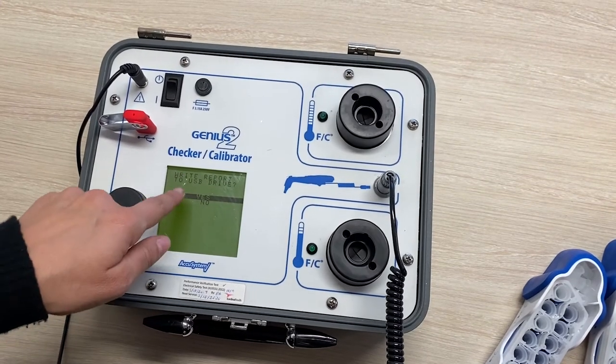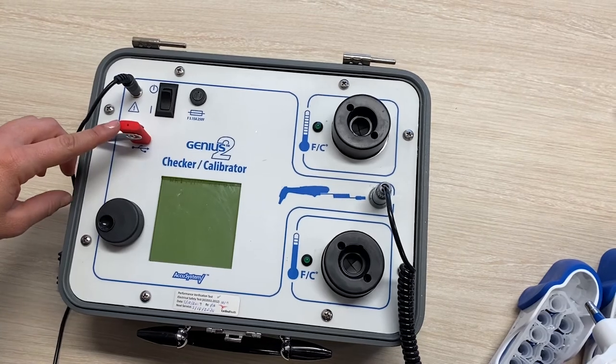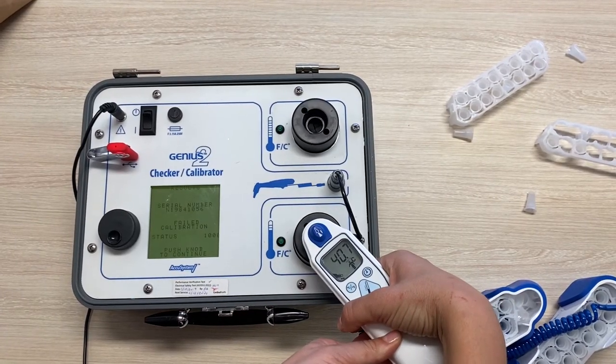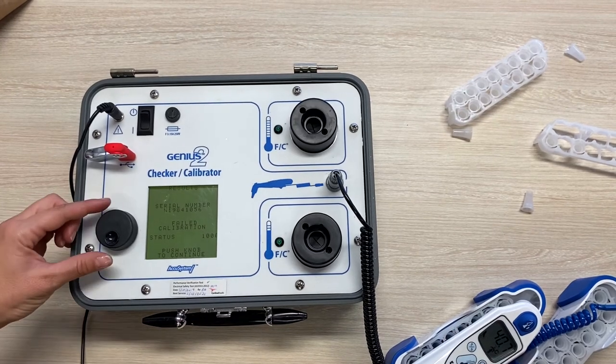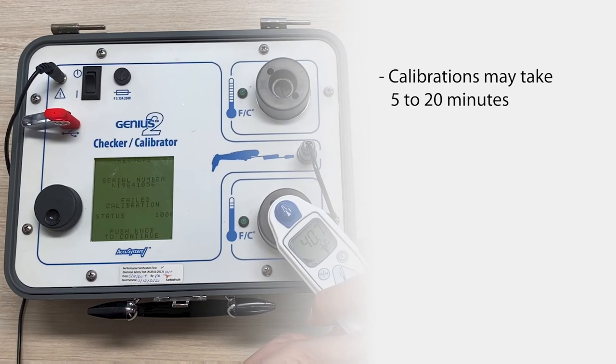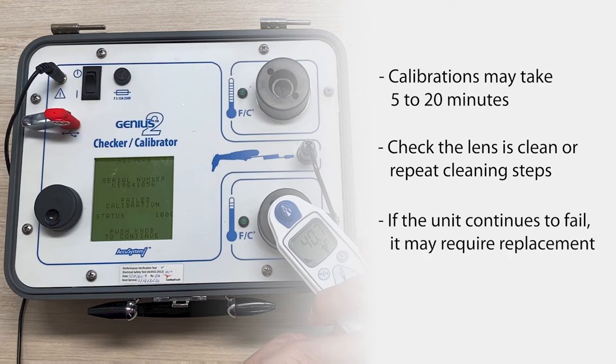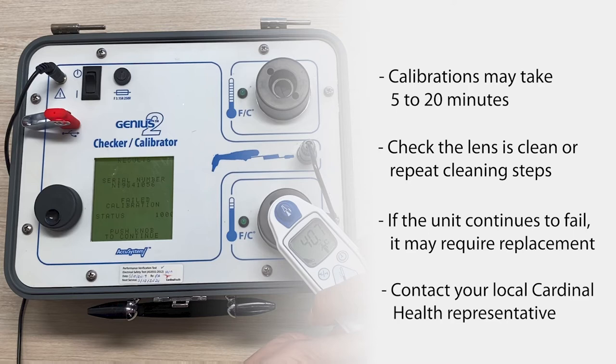If the user would like to obtain a copy of the calibration report, they can select to save it to the USB if desired. If the calibration fails, it may be necessary to repeat the process up to two to five times. Calibrations may take five to 20 minutes depending on how many times the calibration is repeated. If the unit won't calibrate, it may be worth checking the lens is clean and going through the cleaning steps again. If it still isn't working, the unit may require replacement. Please contact your local Cardinal Health representative to organize repair or replacement.